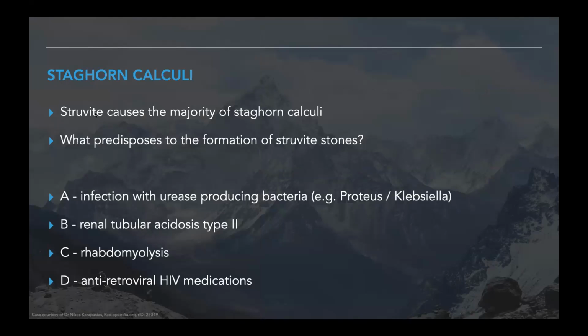So struvite causes the majority of staghorn calculi, but what predisposes to the formation of struvite stones? So another poll, please. Thank you. So this would be the follow-on, if you were in an exam, to the question. So you've got the mark for identifying that staghorn calculi are caused by struvite stones, and now you're trying to get the gold medal by giving the even better answer as to why that happens.